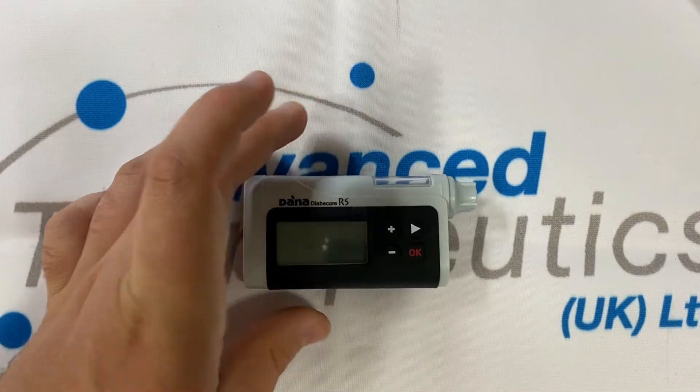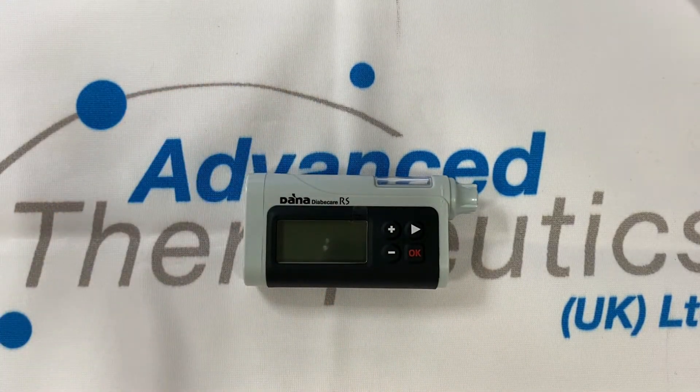The pump is known as an ACE pump, or alternate controller enabled. This pump uses BLE 4.0, or very low energy Bluetooth, to enable a connection to a smartphone for a various number of reasons. This may be because you're using a closed loop algorithm and wish for automatic management of your insulin, or it may be that you're using the AnyDana app as a remote control. This pump is designed to be worn under clothing with discretion and allow you to manipulate your insulin through your own smartphone.